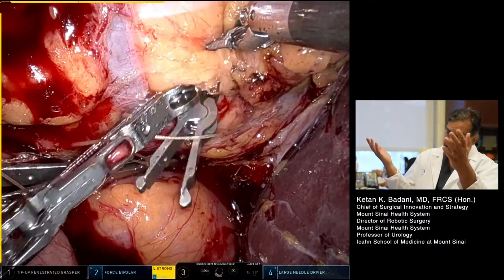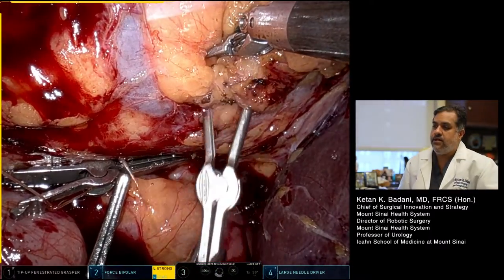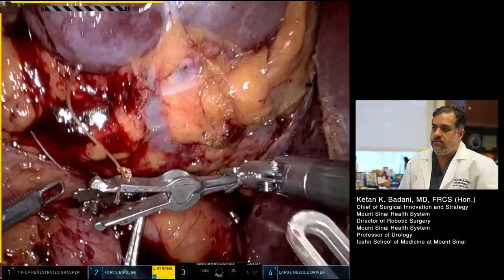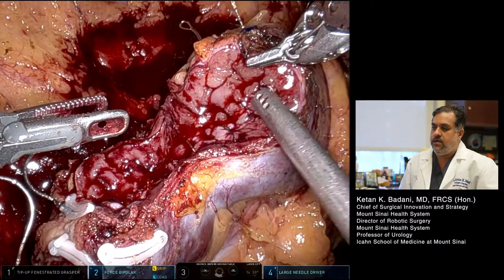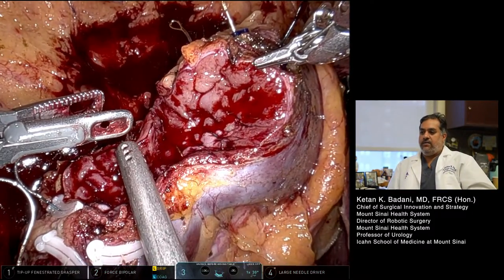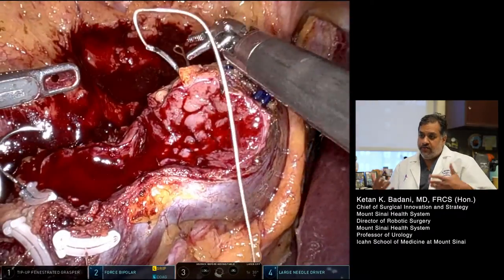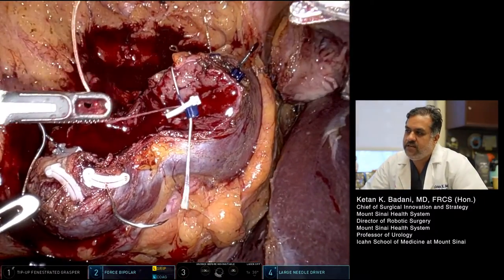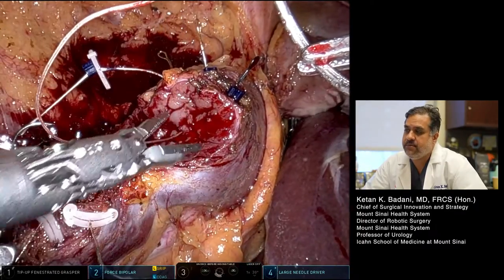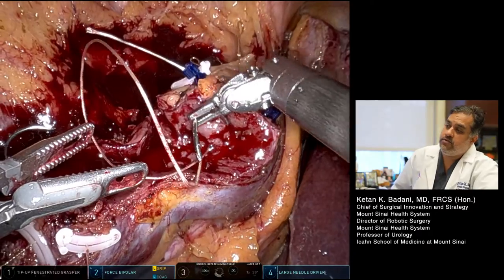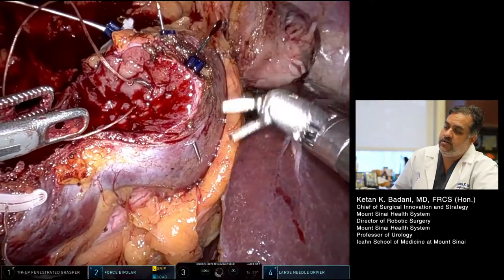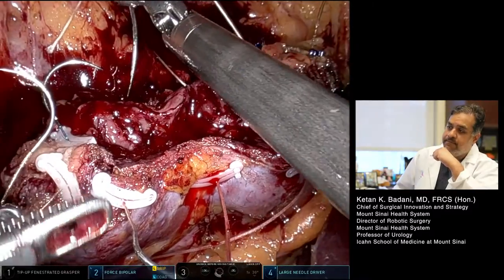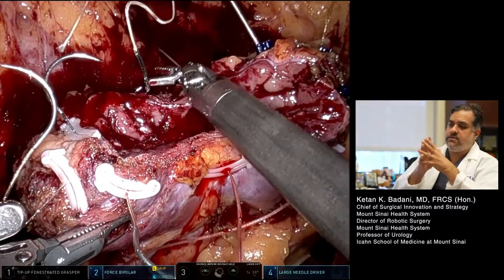We did the inner layer; I'm going to unclamp and look for any arterial bleeders. Because there's no real bleeding, I'm going to remove all the bulldogs so I don't have to worry about that, give the kidney time to reperfuse, and after a minute or so you'll see the reperfusion. No real significant arterial bleeding. The little venous bleeding you see from the cortex is acceptable. Then I'll do my second layer — this is a 0 Vicryl suture, tagged on the end with a clip. I typically try to go full thickness if I can from one side to the other.